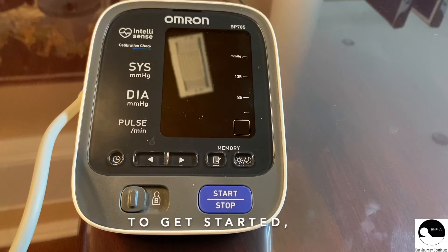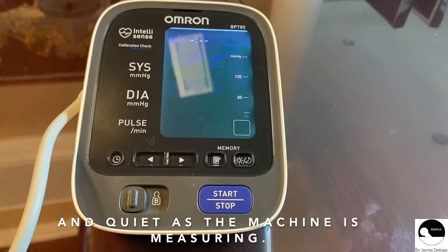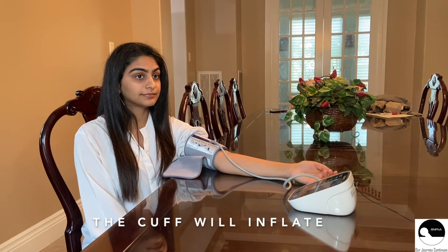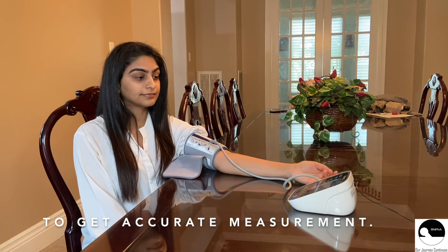To get started, press start and remain still and quiet as the machine is measuring. The cuff will inflate and slowly deflate to get an accurate measurement.